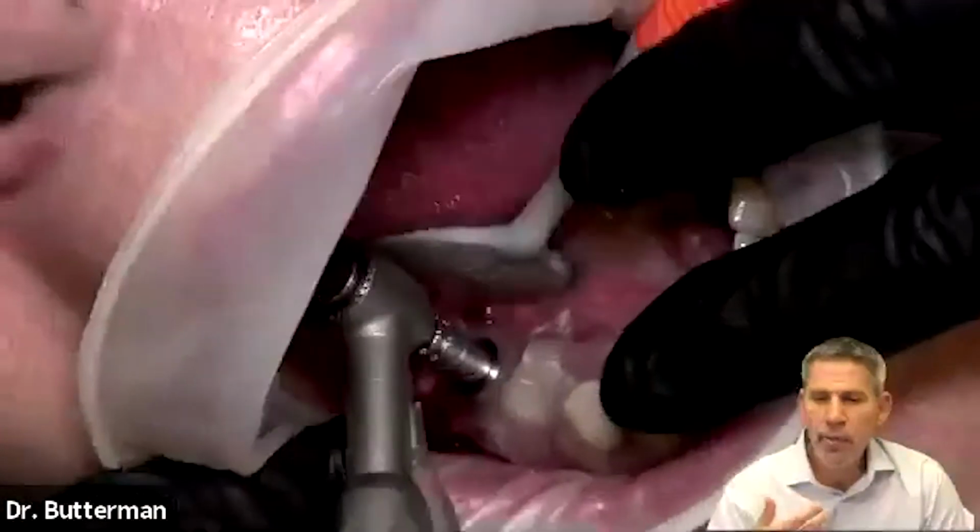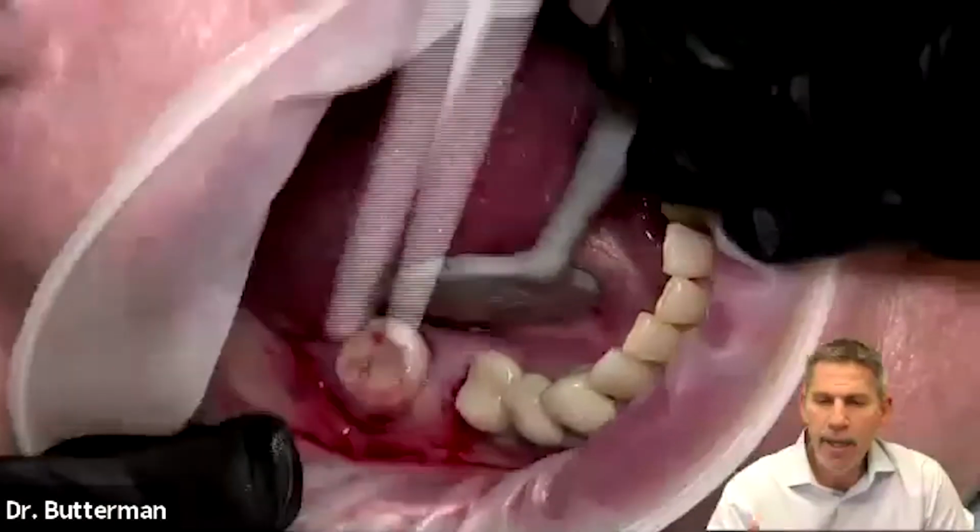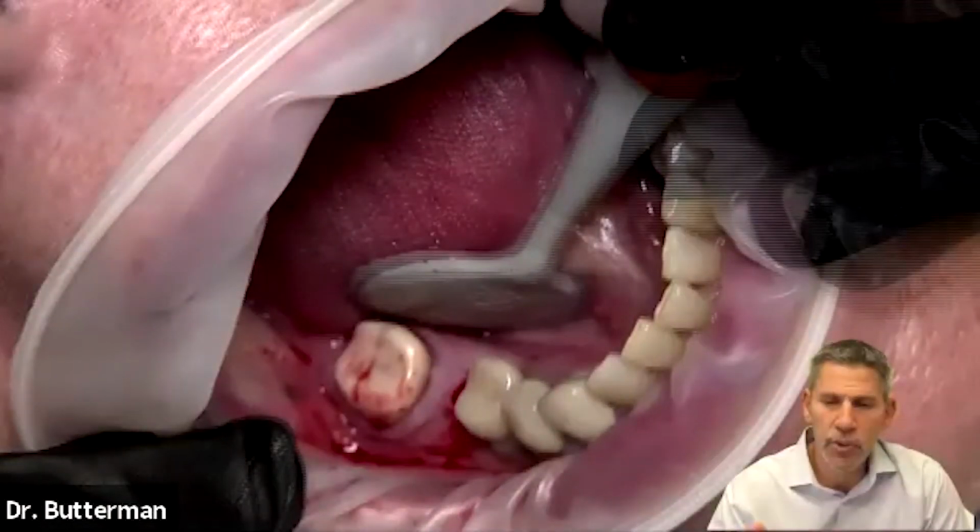So now our implant is there. We're placing our implant guided through the guide, and there is a vertical stop line that I'm watching so that I end up in the right position.